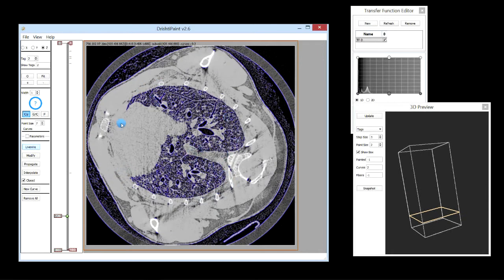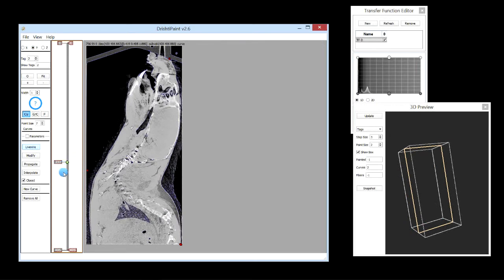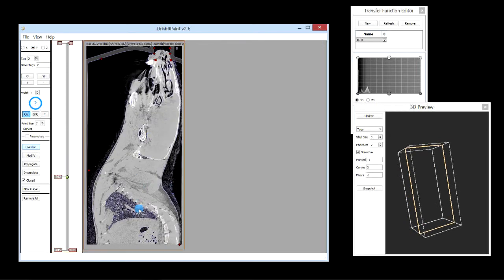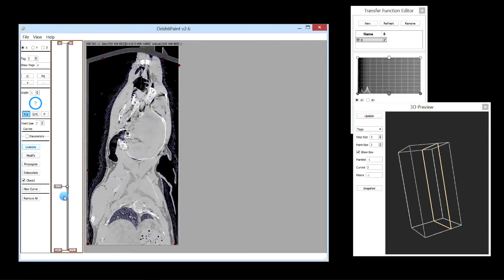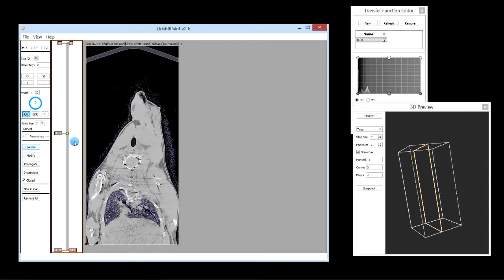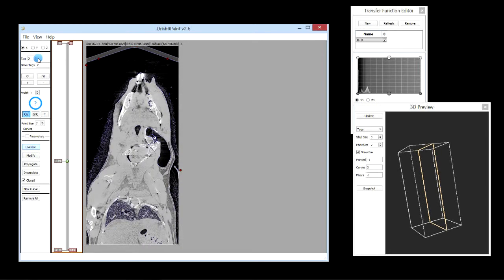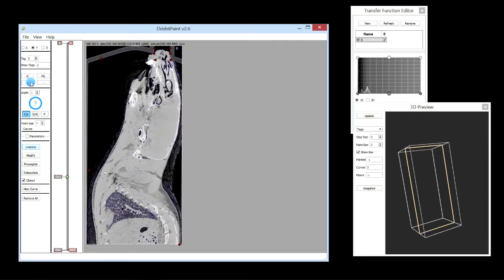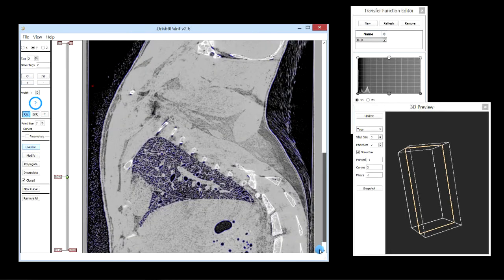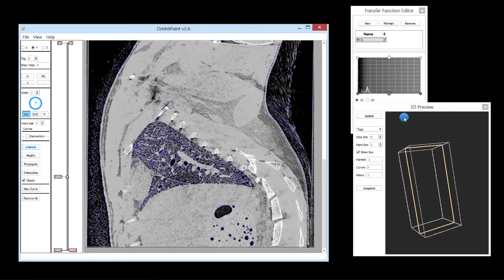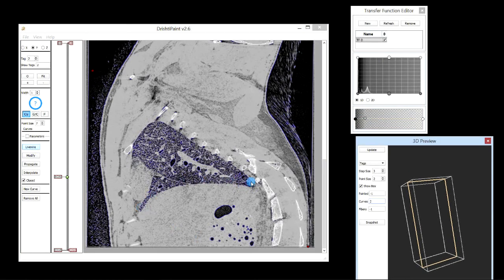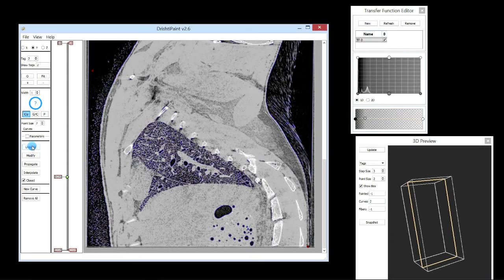This is what we want to segment. It might be better to use the other axis — y-axis or x. We can use the y-axis, so let's increase and get a good view. We might also have to change the transfer function so that the edges are nice and well defined. We will be using live wire segmentation — click live wire, it is already on. If it is not, you can just switch it on.